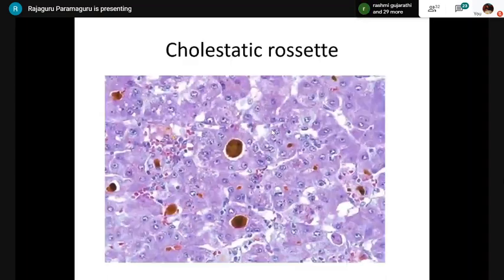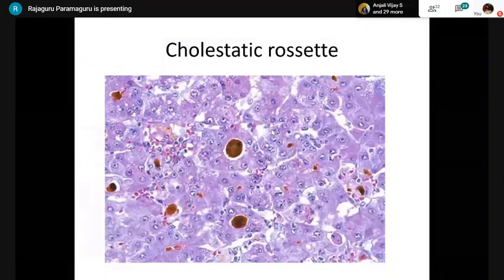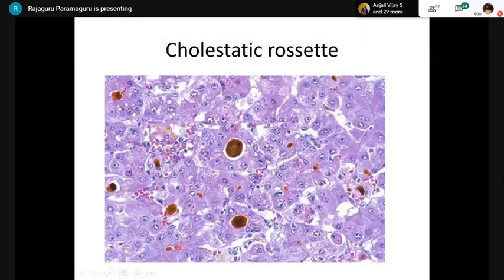Cholestatic rosette: unlike the hepatocellular rosette seen in acute hepatitis, a cholestatic rosette is a dilated canaliculus surrounded by multiple hepatocytes (normally two to three hepatocytes surround a canaliculus). The canaliculus shows bile inside, though bile may be lost during processing, leaving a vacant space.